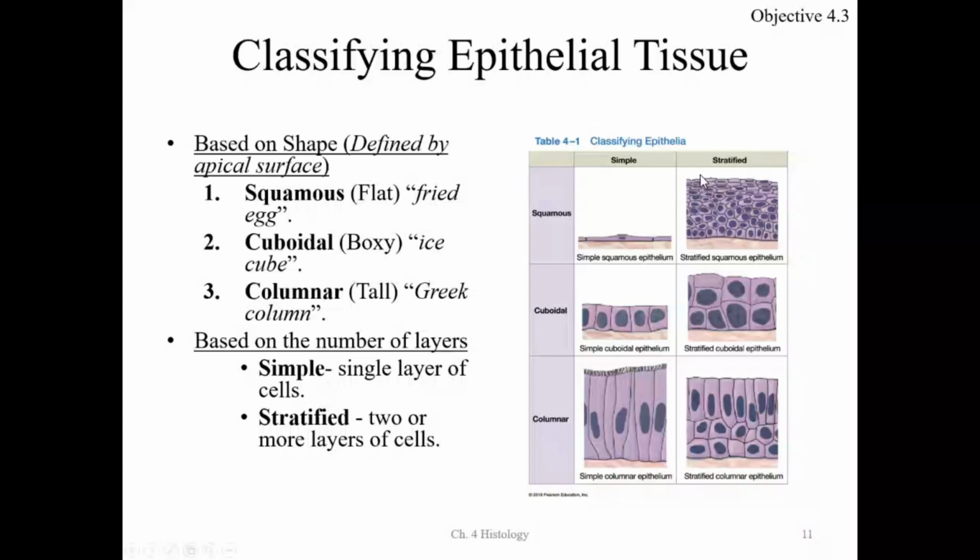So we have flat cells here at the top. That is a word called squamous. Think squash. Cells that are flat are called squamous.